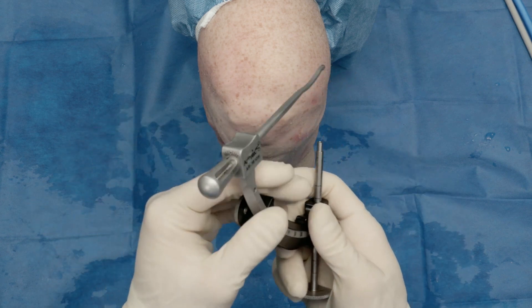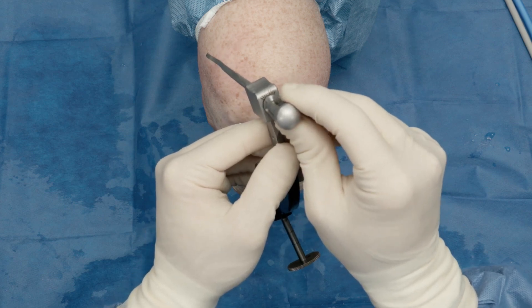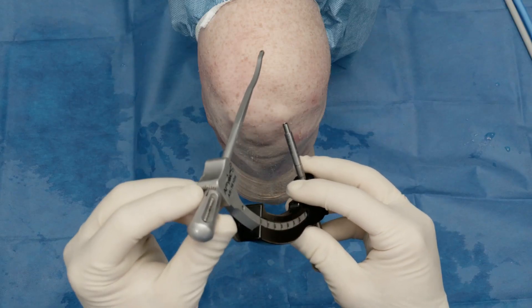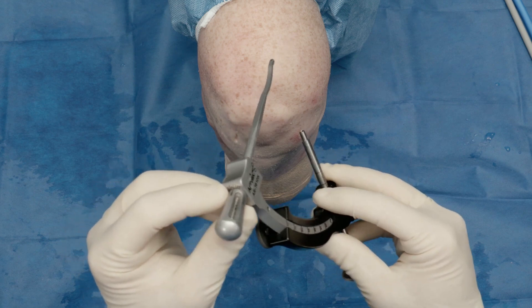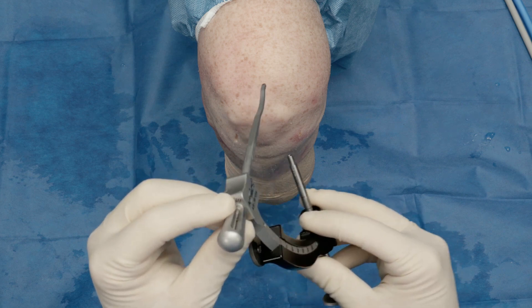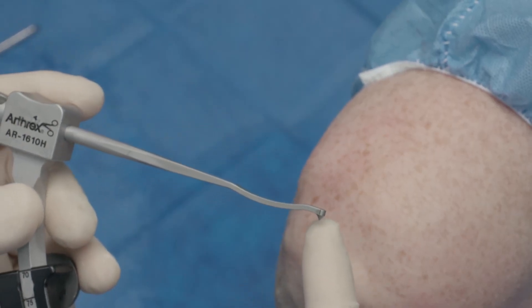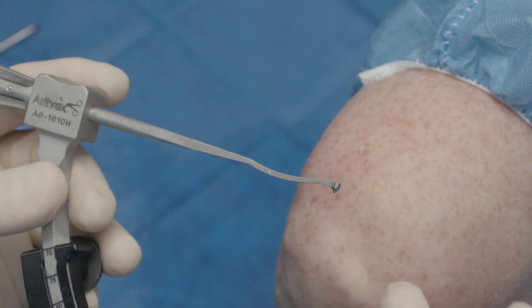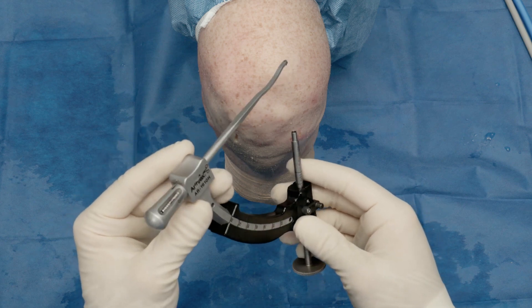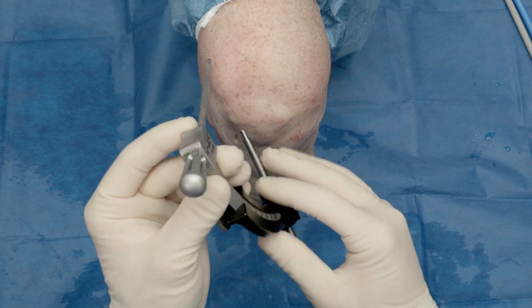A second feature that we like is the ability to have variable angle. This is spring-loaded on the back and you can rotate 40 degrees in either direction. Traditionally when you use an ACL guide for medial meniscus root repair, the problem was the guide would often torque. In order to get your spot in the knee and to line up on the anteromedial face of the tibia, you had to torque through the guide — and what happened is you missed with your guide pin in the back. Best case scenario you missed anatomically in the bone, but worst case scenario you can miss in the back of the knee where there are important neurovascular structures. We'll show you on this knee today how this variable angle can be very helpful and beneficial.